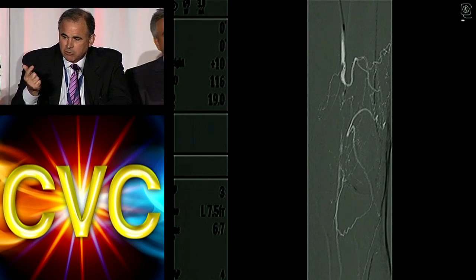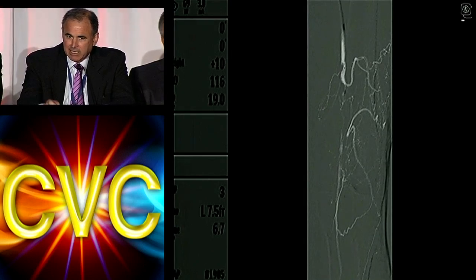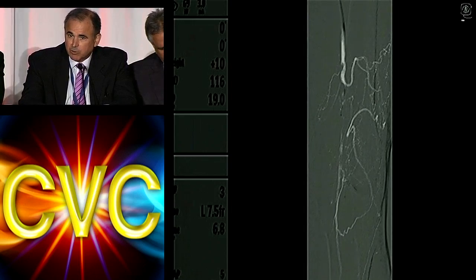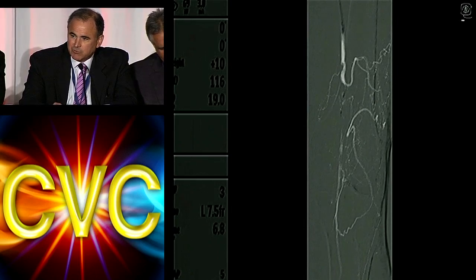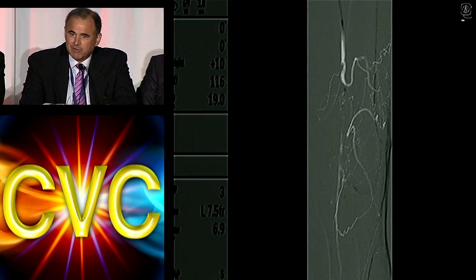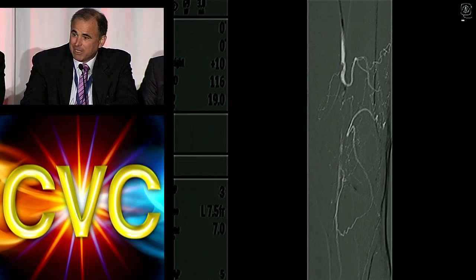It makes it harder to create the initial channel and to dilate it. But we have never, ever, ever been able to show that if we simply remove it, we end up with a better long-term outcome. And so it's an interesting phenomenon. I know we get really hung up on it, but I would love to see that trial that at some point shows that if we take it out, it matters. And I just don't think we have that yet.